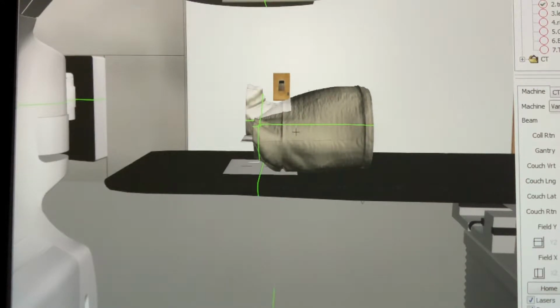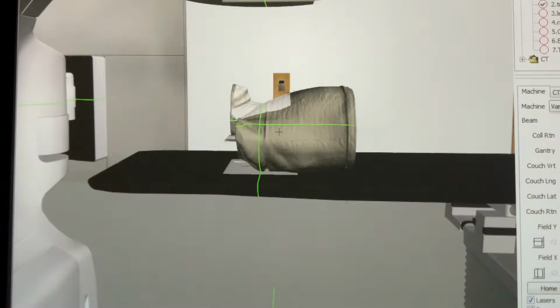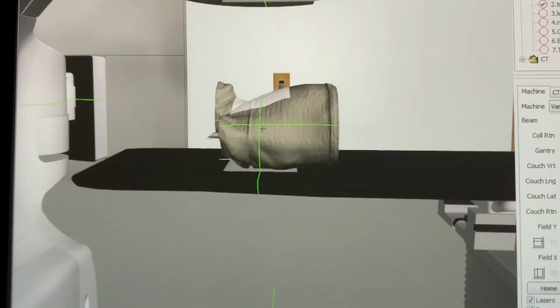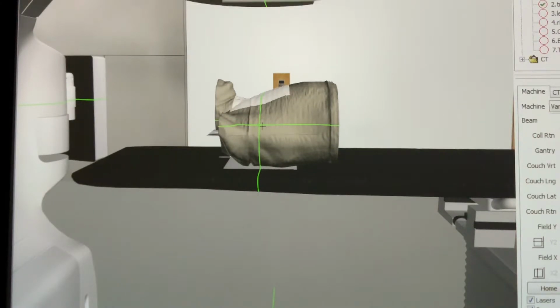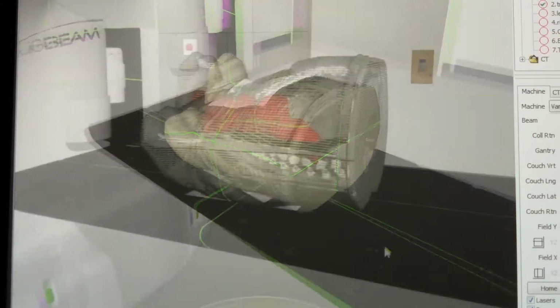To use these marks, we will need to place permanent tattoos on your skin. Depending on your treatment, we will typically give between 1 and 5 of these tattoos. The placement of these tattoos does not mean this is where you are receiving radiation. However, it is in a stable position for the therapist to line you up during treatment.